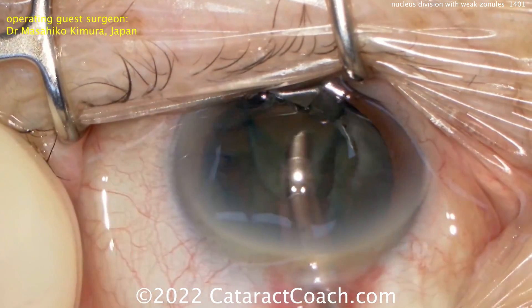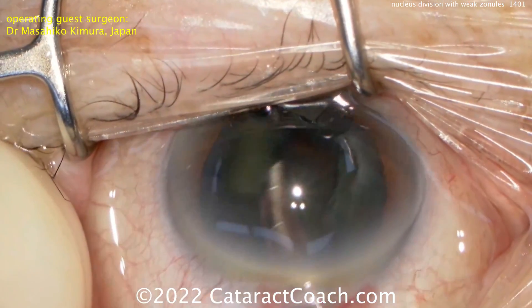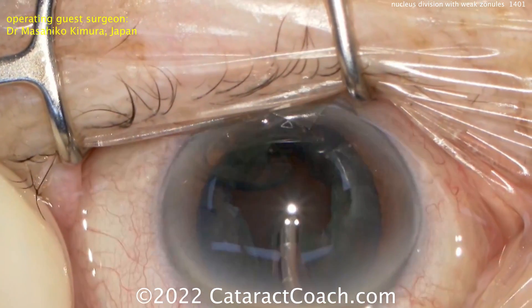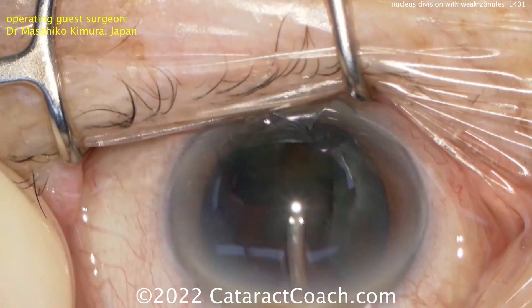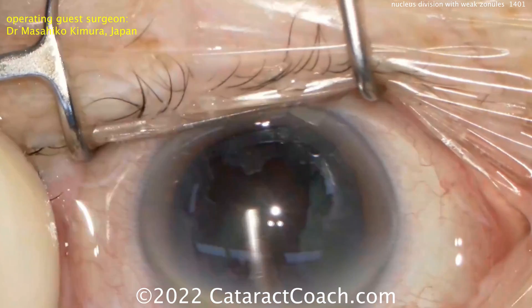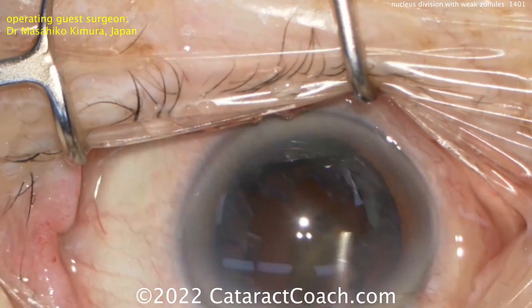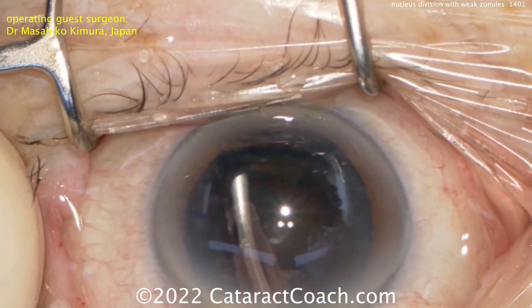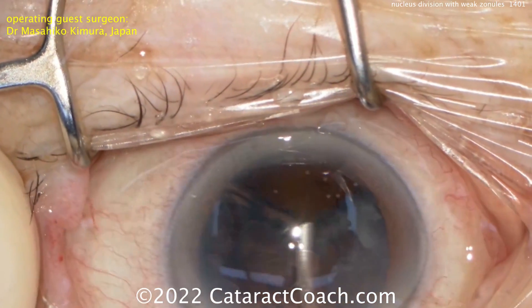Now these all seem like great ideas, and you may think these are novel techniques, but these have been described for many years. In the old days of manual extracapsular surgery, there was a device invented to trisect the nucleus inside the eye to remove it through smaller incisions. So this idea of cutting in a strip is a good one — I like it, and it can be very useful in a case like this.